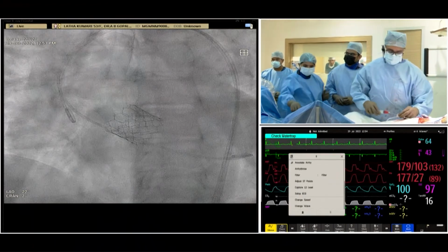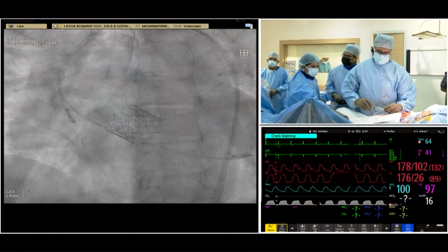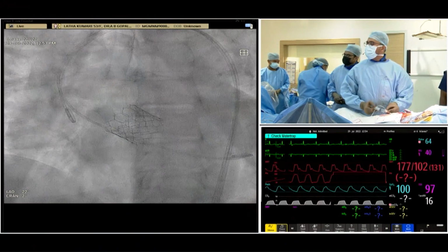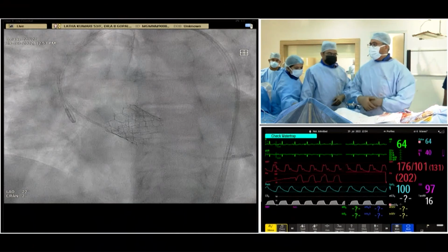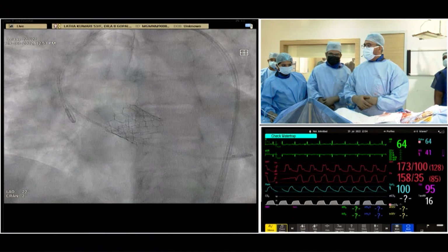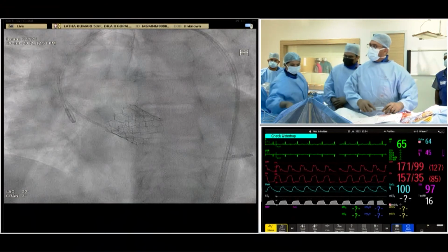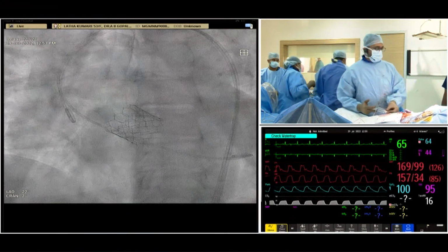Yeah, they're on vasopressors. I think it was given. Probably you're coming down on the pressors now, right, Gopal? Any support? Yeah, we're coming down on the pressures. We just saw the gradient. No support, actually. So we're just coming down to support. There's no gradients, you can see here. 170. Let's flush it, please. Flush and then come back. Flush the line, please, for me.